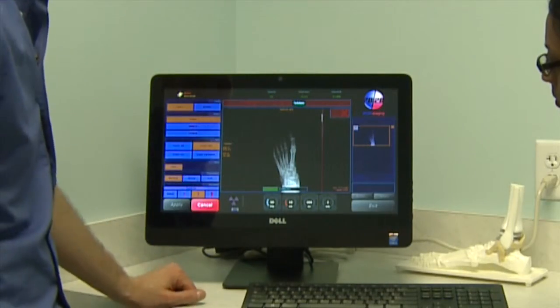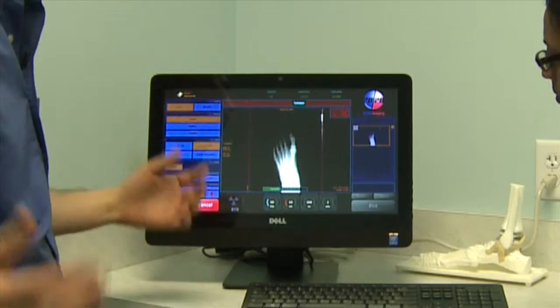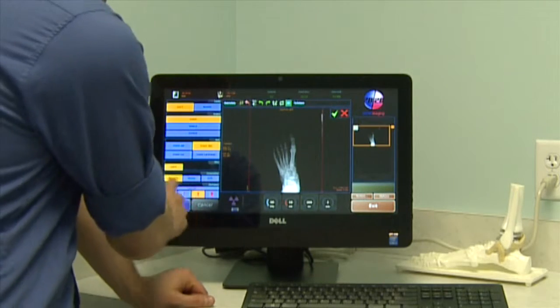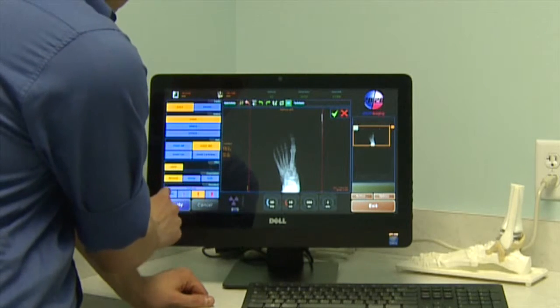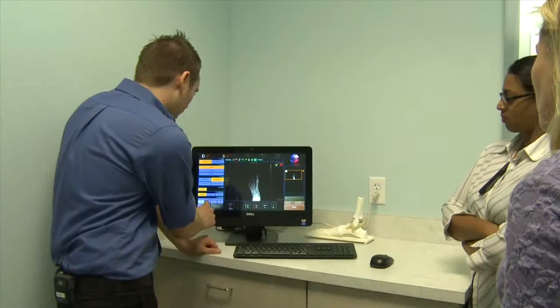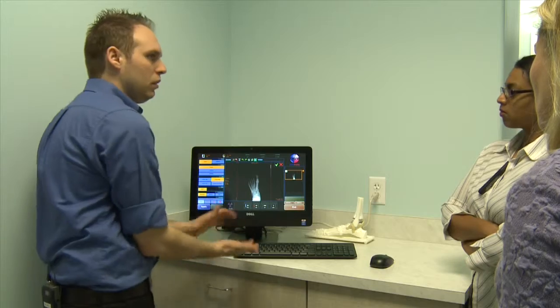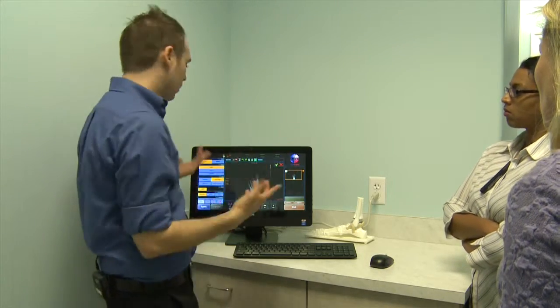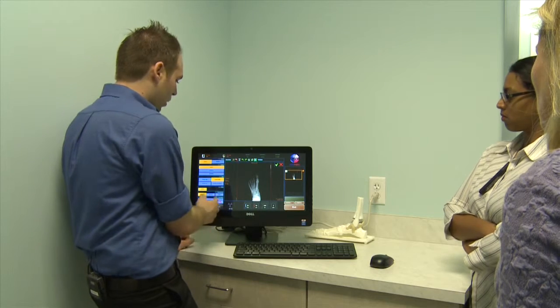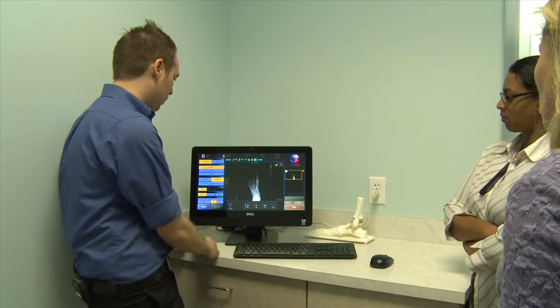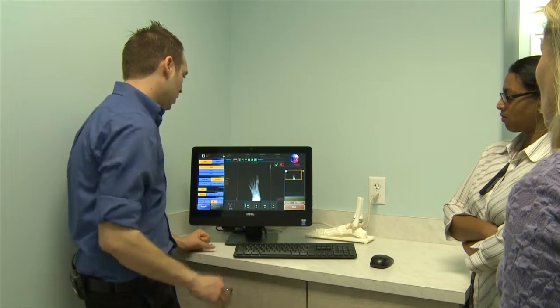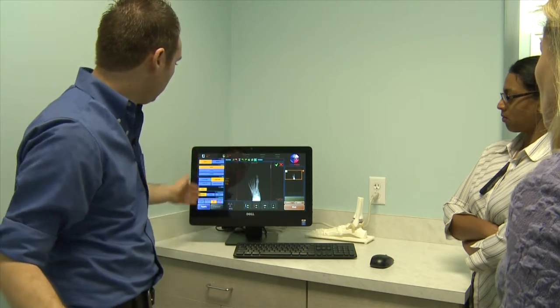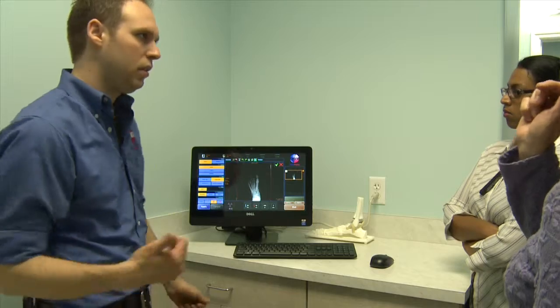Go back to Normal. Soft will make the image softer. You also have size options: adult and pediatrics. Pediatrics handles children, and if you have a bigger foot you can compensate, but normally stay on the middle setting. Simply select the next view, position the patient, take the next one, and continue on.